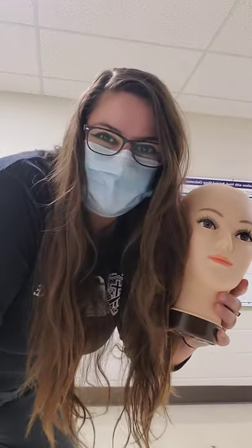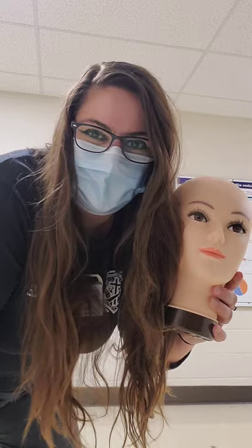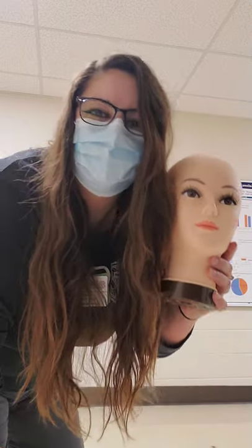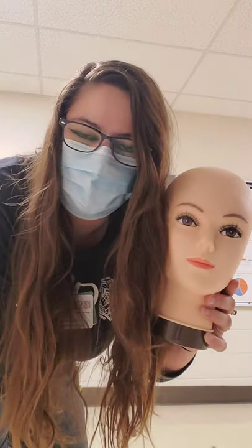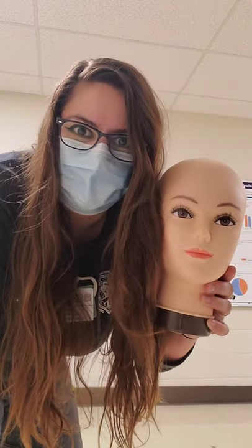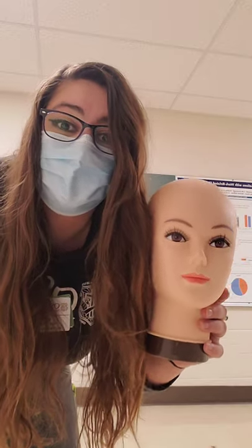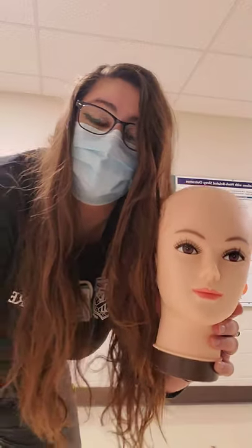Hi, my name is Amanda. Today we're going to go through steps one and two of the 10-20 measuring system for EEG technologists.